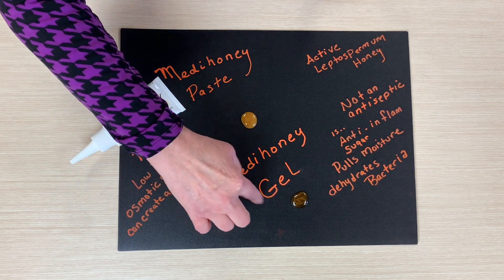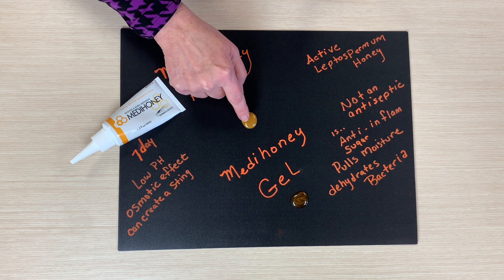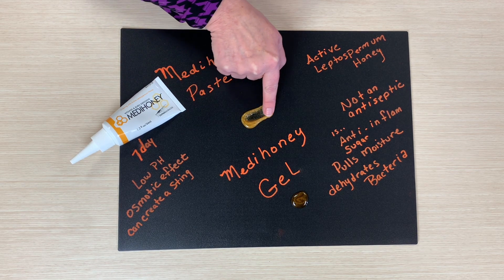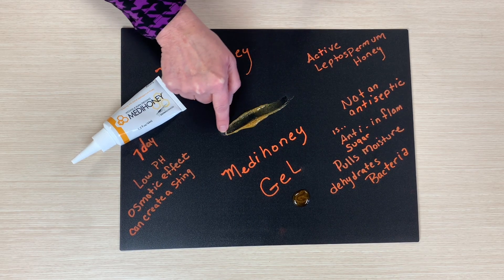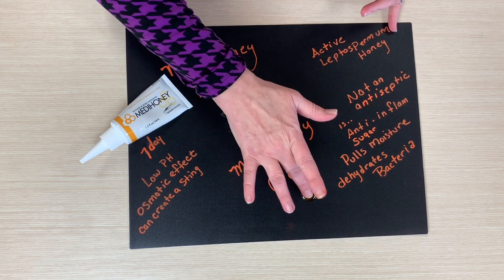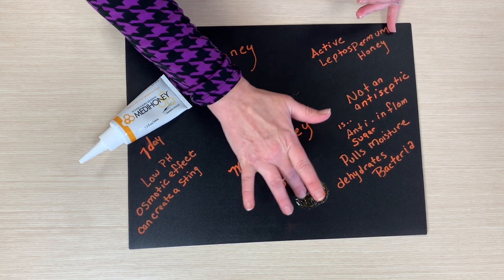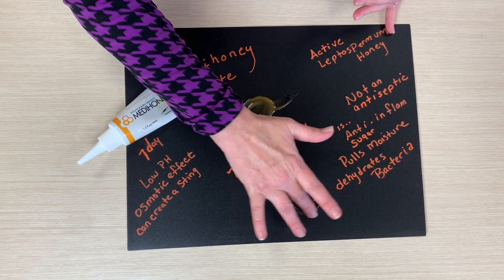The gel is really great for radiation and chemo burns — so good for that. I just wanted to smear it a little bit so you could see the texture of it, just to see what it would look like as you're spreading it. The gel feels a little bit more gritty than the paste.